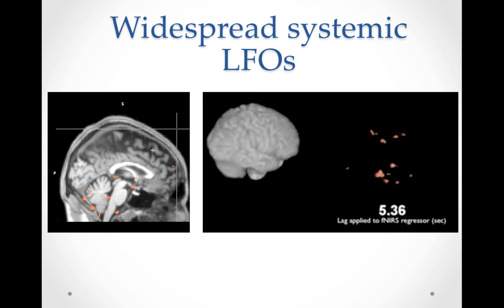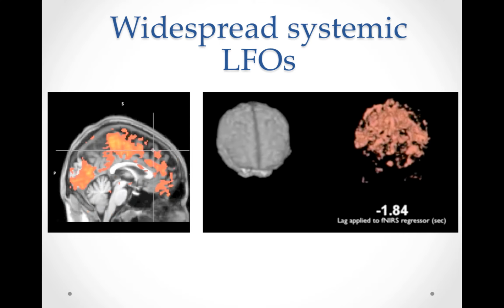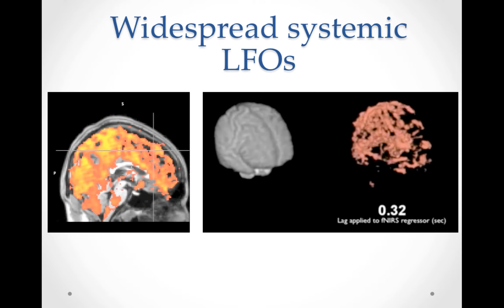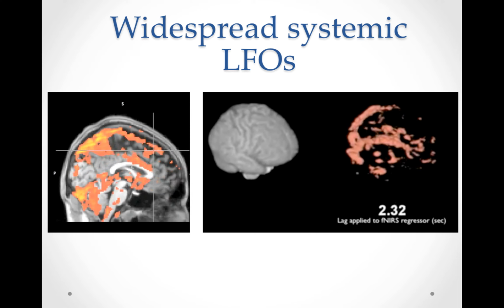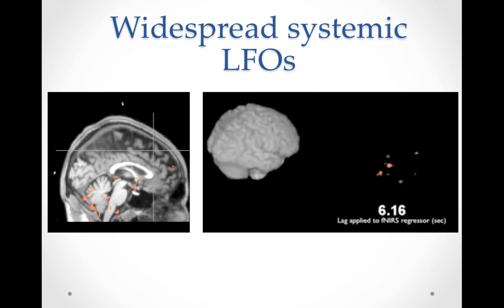So summarizing, we had found a way to measure purely non-neuronal LFOs through peripheral NIRS measurements, and found that these non-neuronal LFOs are globally present, traveling through the entire body including the brain with various time lags.